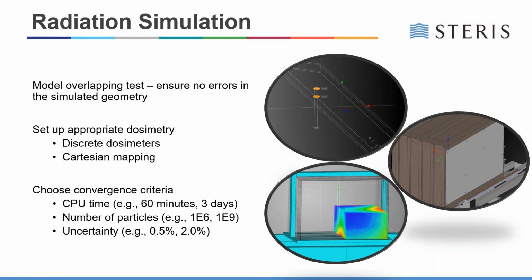Now, being able to quickly remove these overlaps and correct for them is essential to being able to have a rapid process where simulation can be used effectively. And this is also integral to being able to make sure that the CAD models that you import into your software are representative of what is actually sterilized.